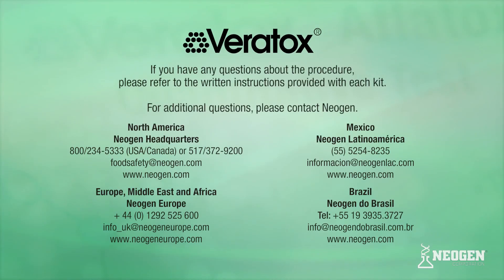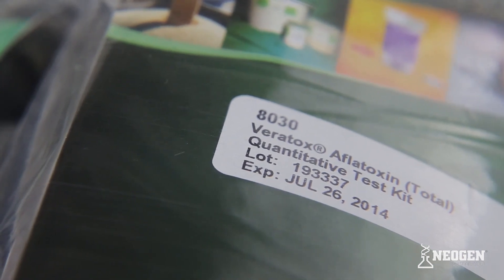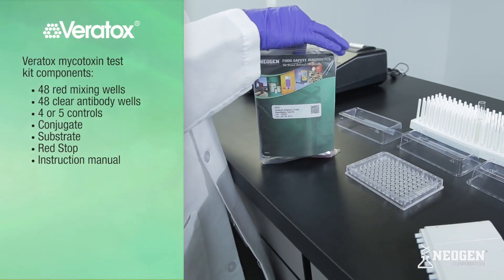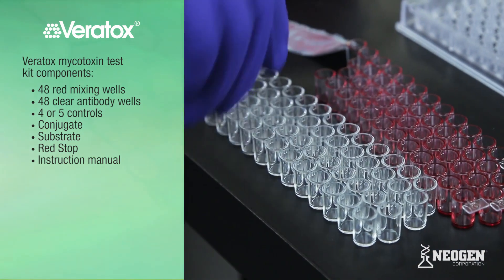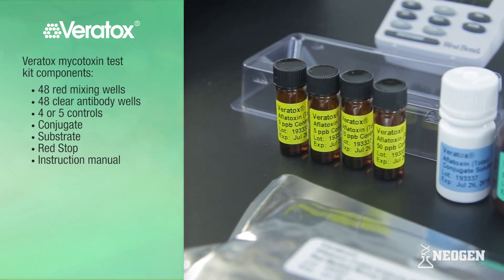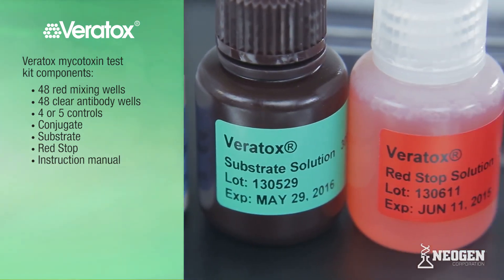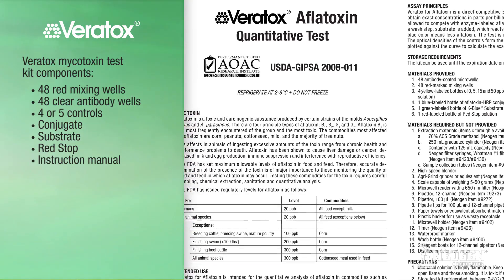If you have any questions about the procedure, please refer to the written instructions provided with each kit or contact your Neogen representative. For this presentation, we will be demonstrating Neogen's Veritox for Aflatoxin. All test kits are generally run the same, but exceptions will be noted where relevant. Each Veritox mycotoxin test kit contains 48 red mixing wells, 48 clear antibody wells, four or five controls, conjugate, substrate, red stop, and an instruction manual. The Veritox Fumonacin 510 and 1010 kits also include pre-filled dilution bottles.